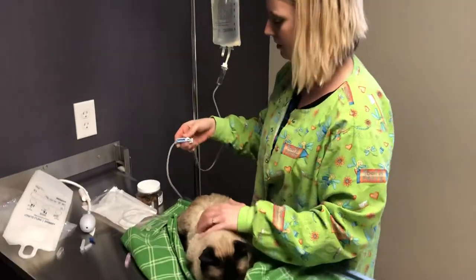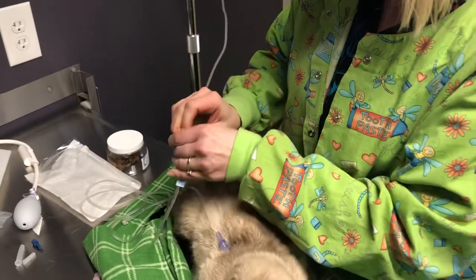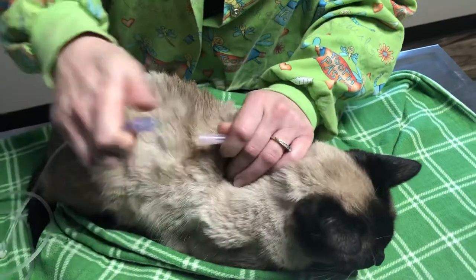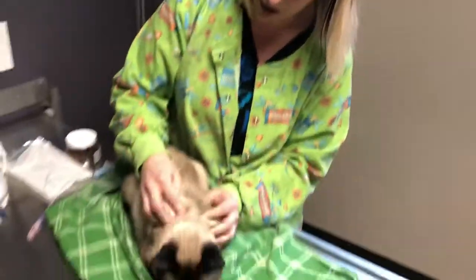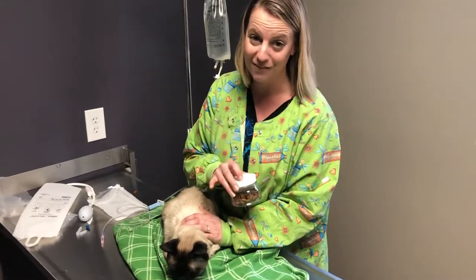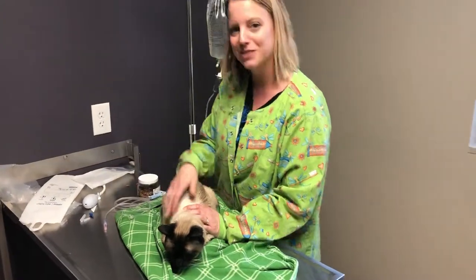When you're done with fluids, go ahead and close off the valve. Then put your finger over where the needle is and pull out gently. He's got a nice little lump — it's not too hard, he's an amazing patient. You'll need to use a new needle every time and you need a sharps container to dispose of them properly. Afterwards, make sure you reward your cat or dog with a treat if they're allowed to have one. If you have any other questions, just give us a call.